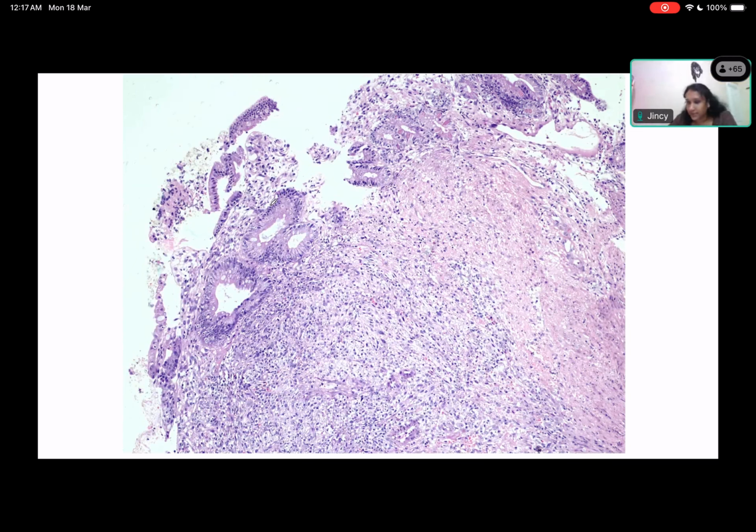Ma'am, it's a gastric lesion. The epithelium is seen slightly ulcerated, and it's rising to the submucosal region. On the right side, there are areas of necrosis that I can see, and the glands look a bit distorted, like dilated. Okay. So what are you seeing under this glandular epithelium? You described this glandular epithelium, and then there is this area underneath. And you said on the right side, you can see the pen. I'm not marking anything, but can you see the pen like a cursor? Yes, ma'am. Okay, so you said that on the right side there is some necrosis. And what is happening in this region?